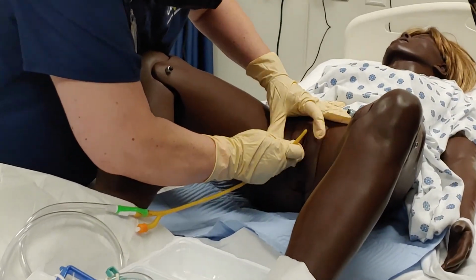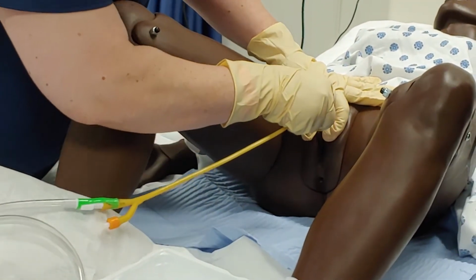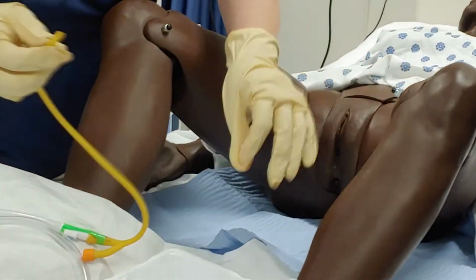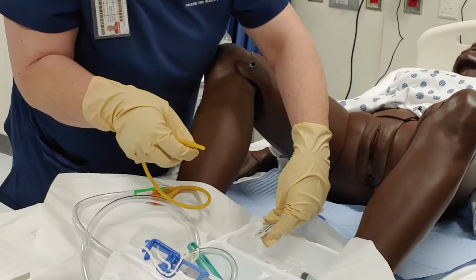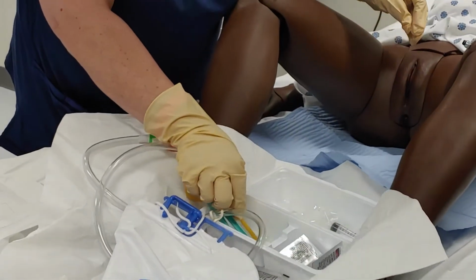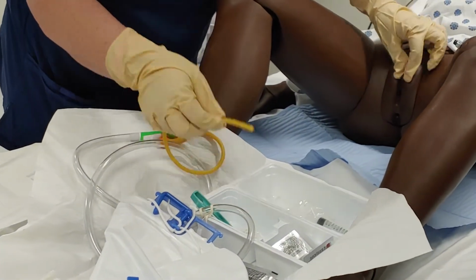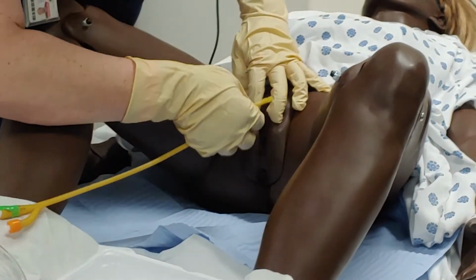Okay, and we're going to insert it into the urethra. Oh, I'm going to actually have to put lubricant on it. That ain't moving. Okay. All right, so we're going to hold that apart as best you can.